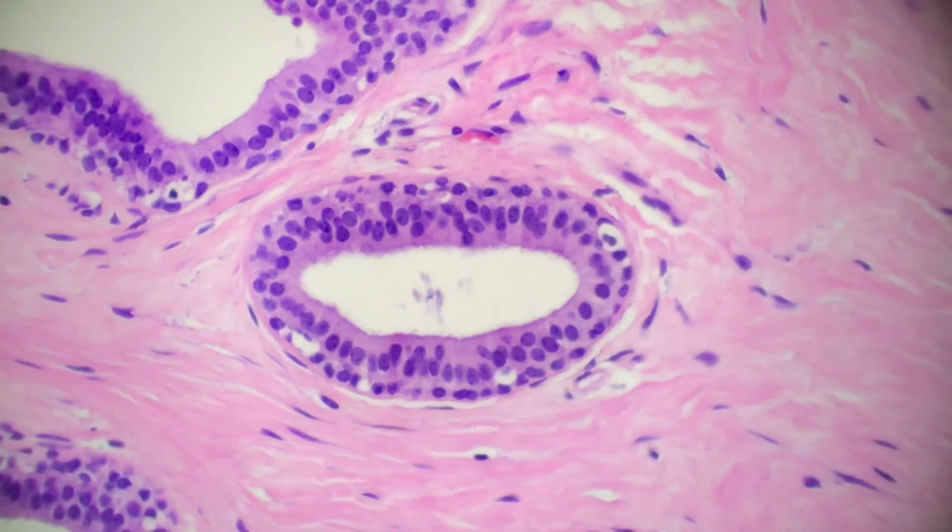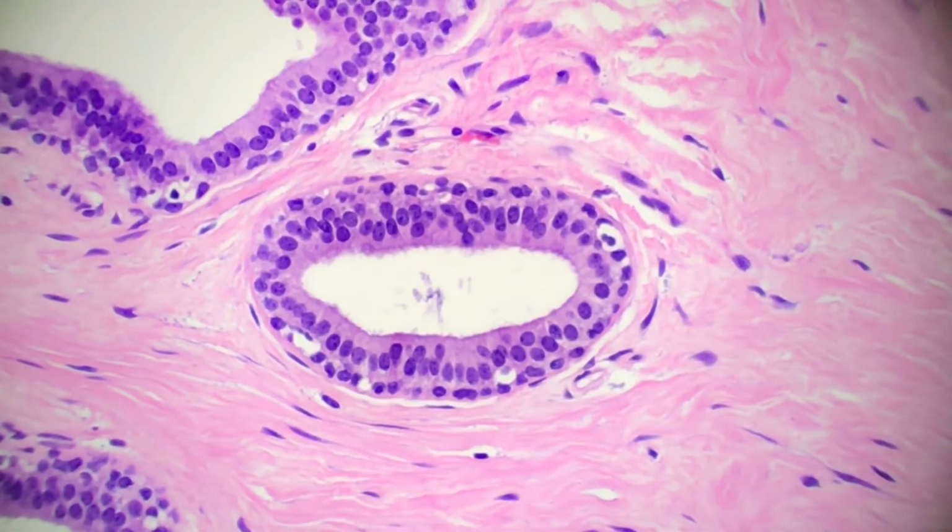So what you notice with myoepithelium, if we zoom in even higher to 20x, okay, is that sometimes they have these vacuoles within them, so hopefully you can appreciate that. And they're always immediately underneath your epithelium, okay? So when we talk about in situ components versus invasive components, the in situ means that it has that intact myoepithelial layer. So that's what you're looking for when we're talking about things like DCIS or LCIS, okay?